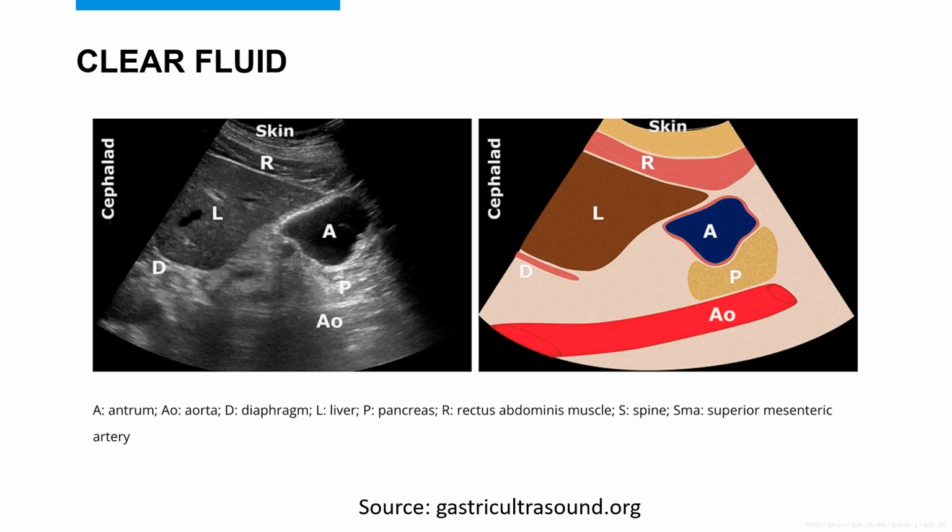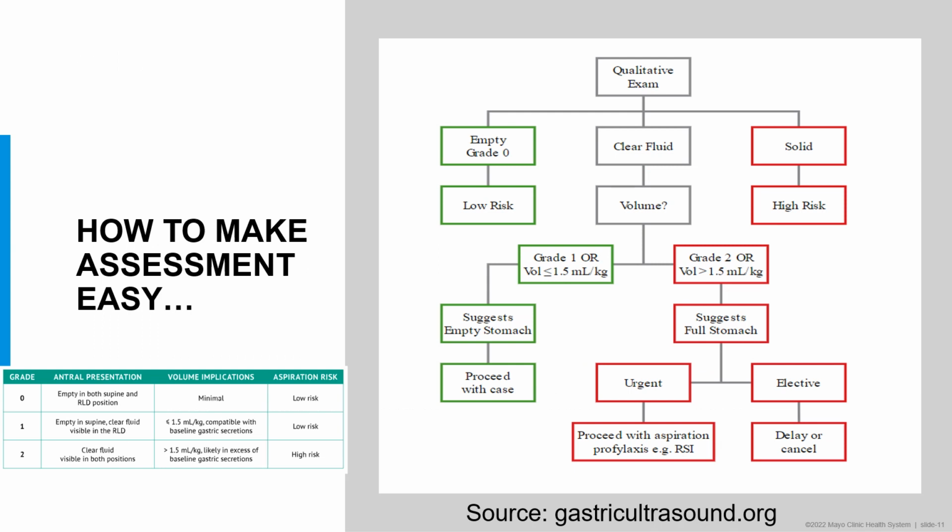As a physician, we need to discern, is this clear liquid just naturally produced gastric fluid, or is this someone who recently drank a significant amount of clear liquids? This is where we get into the clinical application of our assessments. To make the clinical application easy, we're going to break things into qualitative and quantitative assessments. I'm going to start with a quick and easy qualitative assessment.